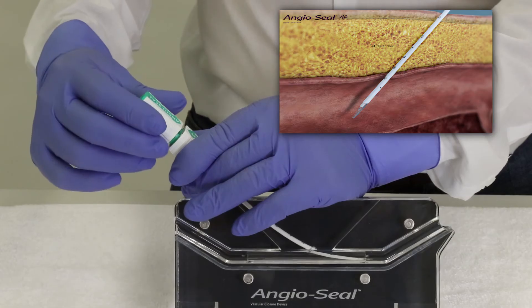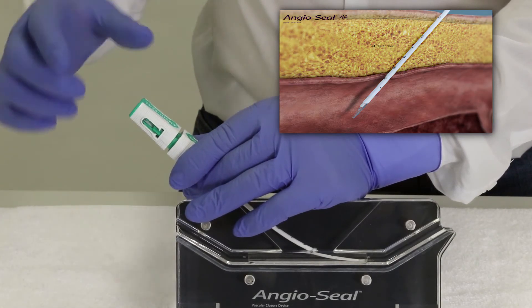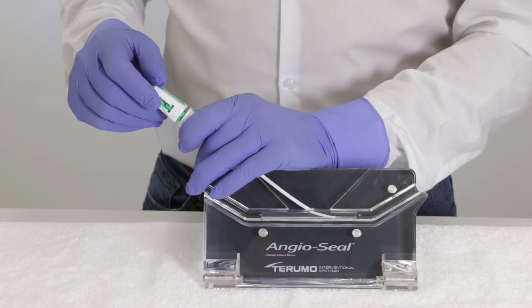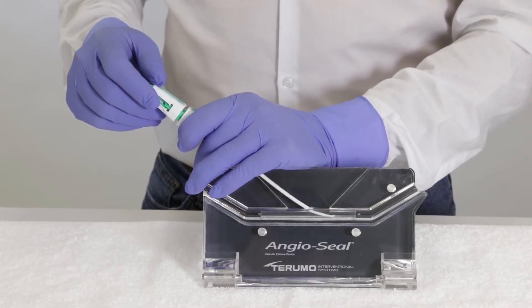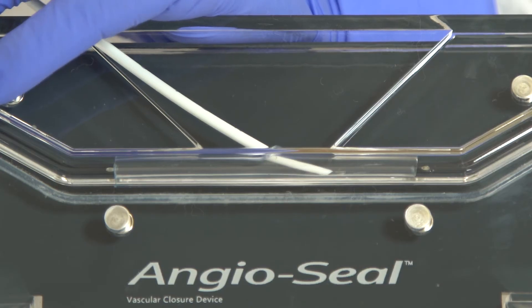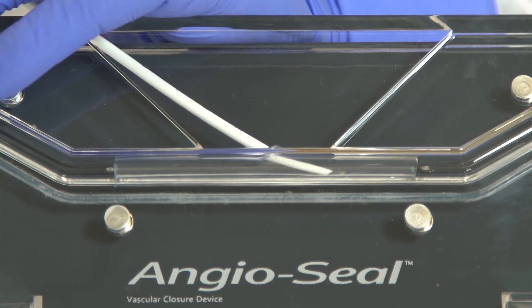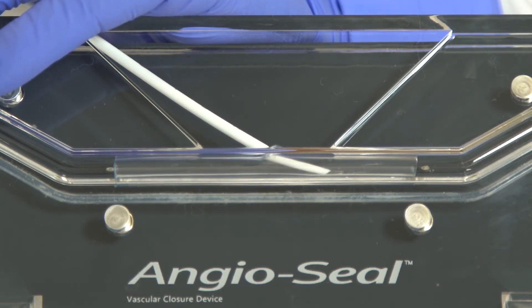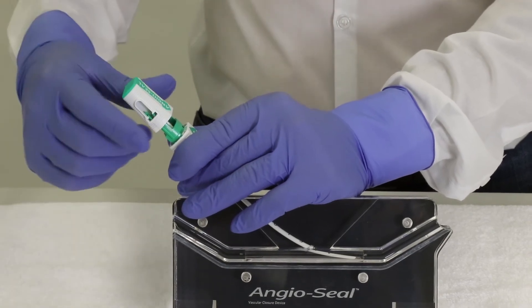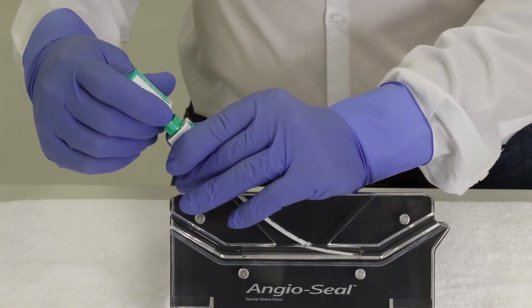The two arrows must be aligned and you should hear a click. This first click means that the anchor is out in the vessel, but it's floppy. While the left hand remains still holding the sheath, grab the Angioseal device cap and pull back. A next click will tell you that the anchor is locked against the tip of the sheath. The white marker should be exposed on both sides. This step is called set the anchor.